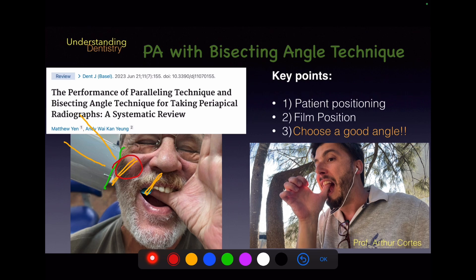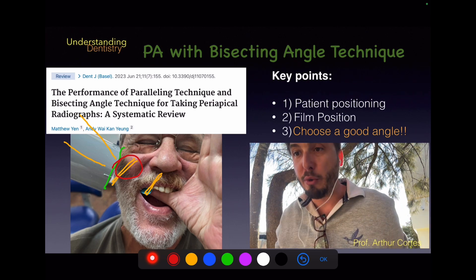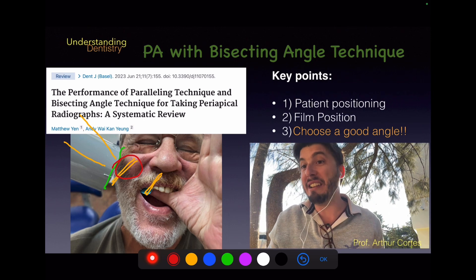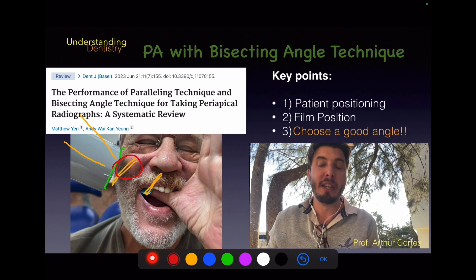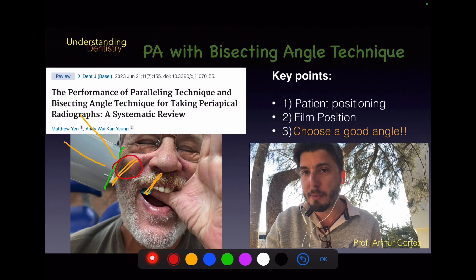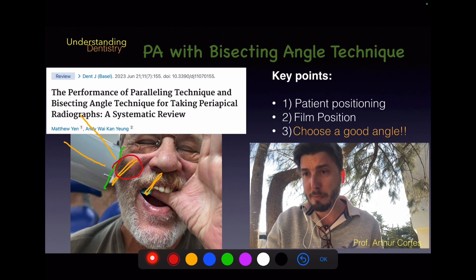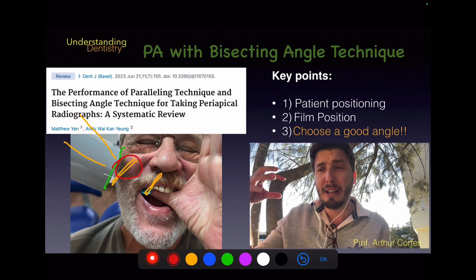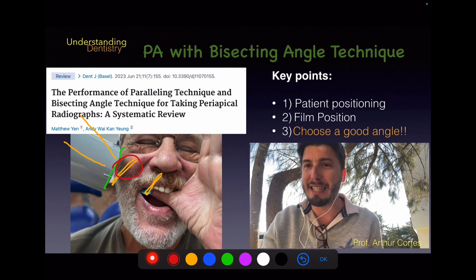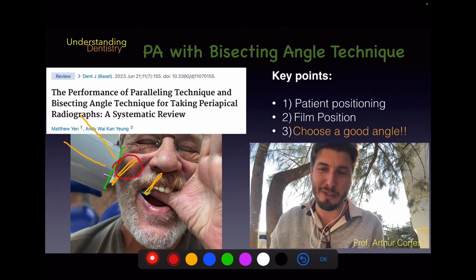For anterior teeth, the vertical angle is higher — almost 45 degrees — because of the curve of the maxilla and the shape of the roots in that region. When the patient positions the film on the anterior teeth, you will naturally realize that a higher angle is needed. Train this procedure: start almost parallel, adjust the angle slightly higher, and you will get good bisecting angle technique results.